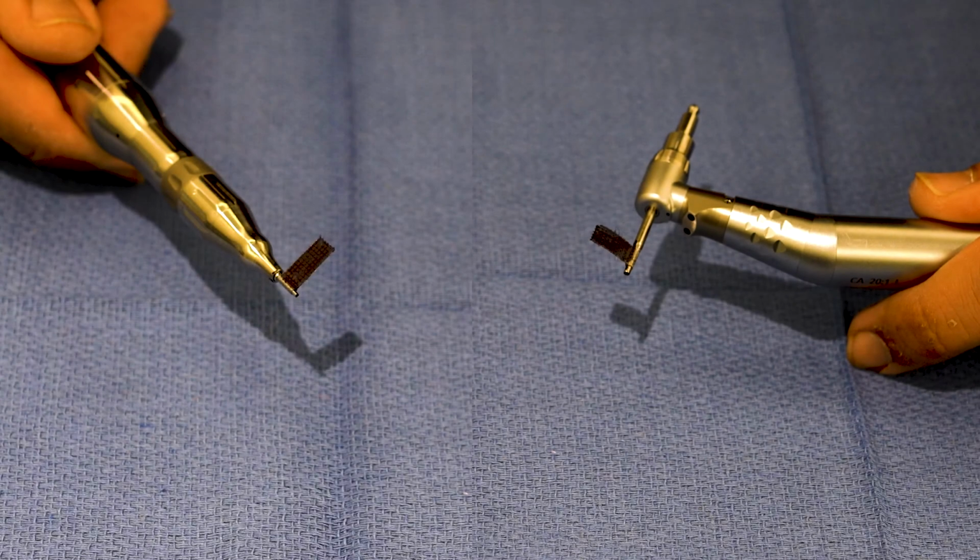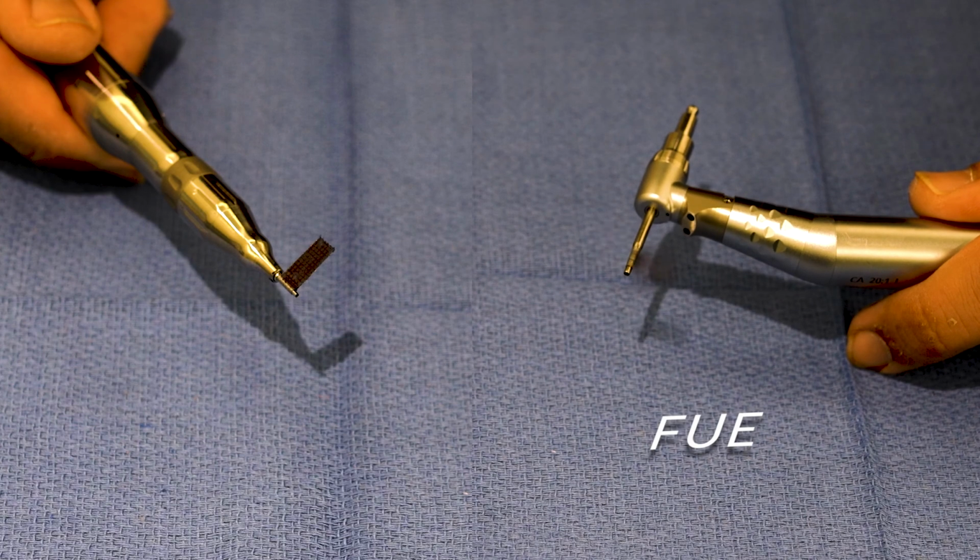Okay, so here we are in the procedure room. We're going to take a quick look at our devices and compare them. Remember, the standard FUE device is a rotary device, has a sharp cylindrical blade, and it's going to cut right down the hair shaft to get to the follicle.